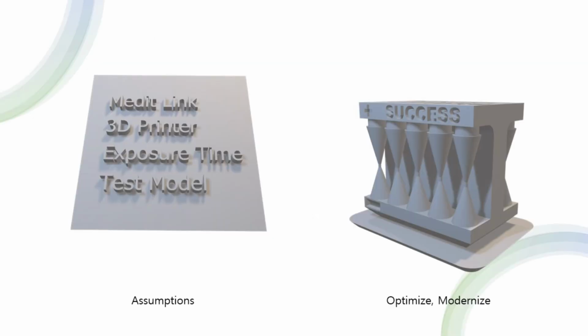In this part, we examine two test models to understand how specific settings in the 3D printing process impact the final output. These models visually demonstrate the importance of fine-tuning various printing parameters. The first model showcases the effect of exposure time settings on the surface finish and detail of the output. It provides insights into how exposure time influences the quality of the final product, emphasizing the importance of optimizing exposure time for resin curing and quality.